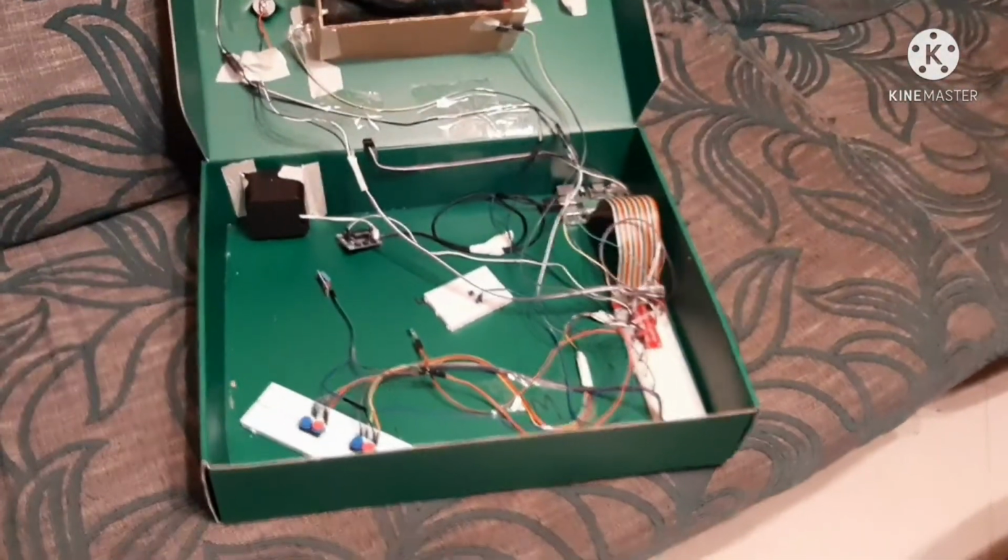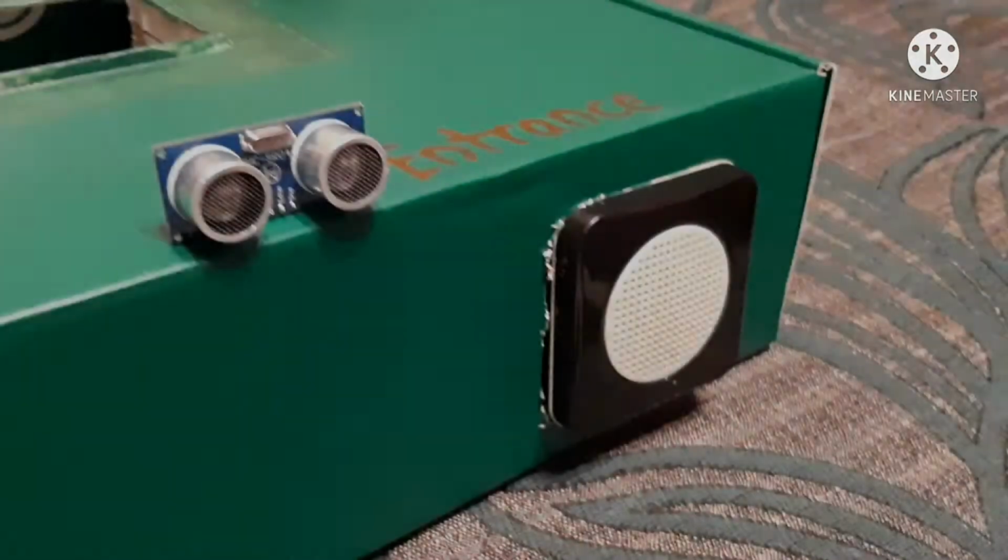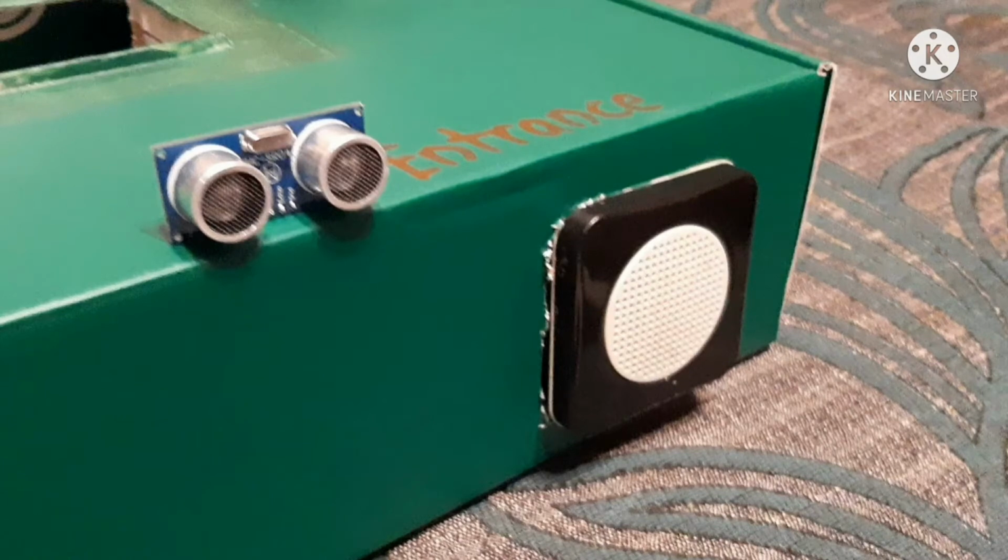Now let's look at the connection for Raspberry Pi A, as in A for alone, standalone. Raspberry Pi A controls all exterior requirements. At the entrance, you'll see an ultrasonic sensor to detect visitors and a speaker for notification.